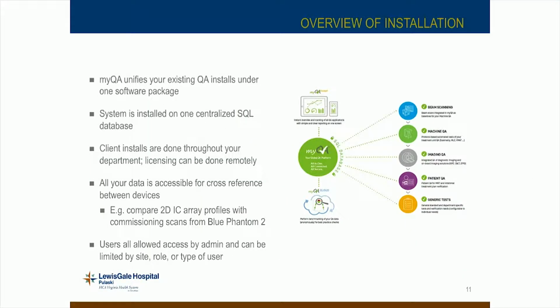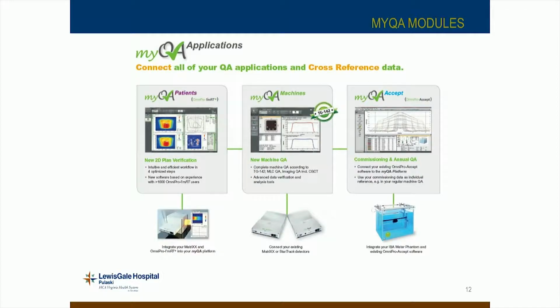So the overview of the installation. myQA unifies all of your existing QAs under one software package. If you were using different versions of IBA software prior to myQA, this takes everything and adds it into one nice piece of software. So you have different modules inside myQA.